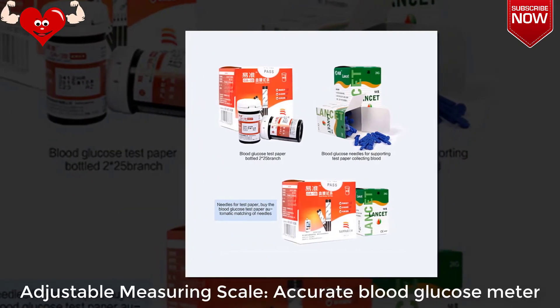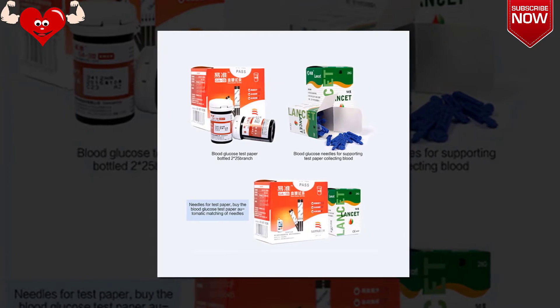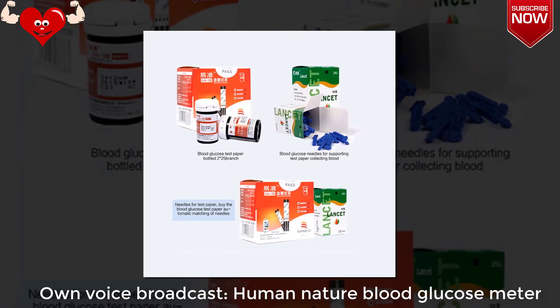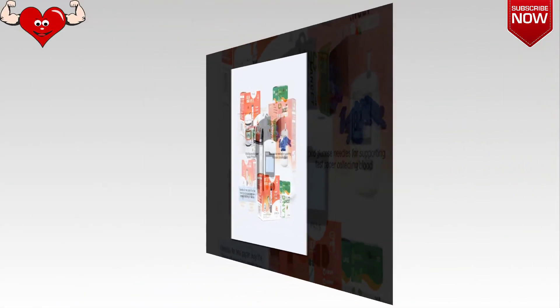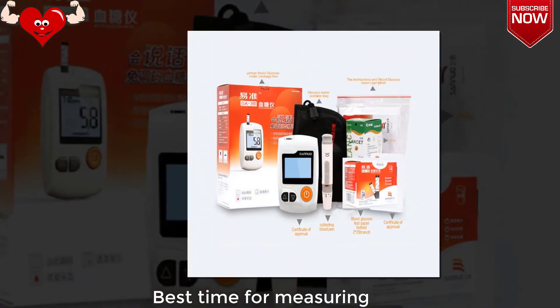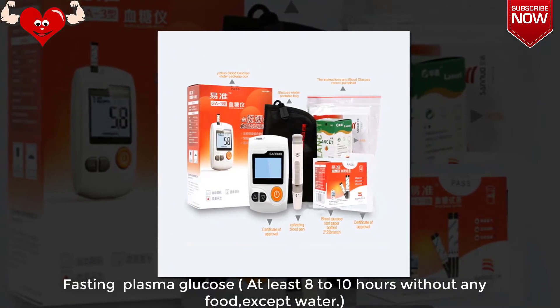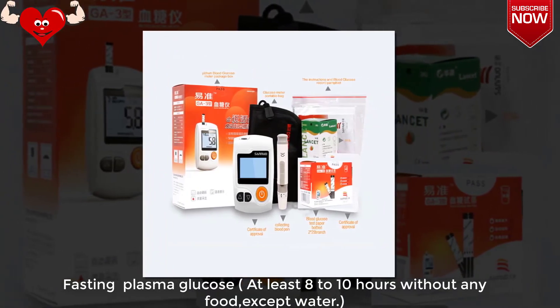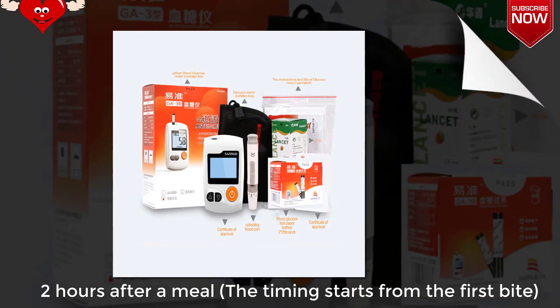Adjustable measuring scale, accurate blood glucose meter with voice broadcast. Best time for measuring fasting plasma glucose: at least 8 to 10 hours without any food except water.